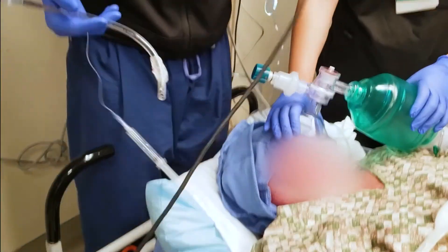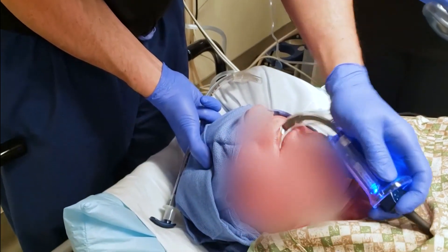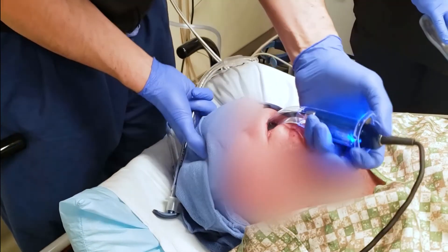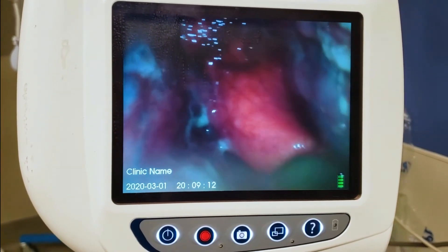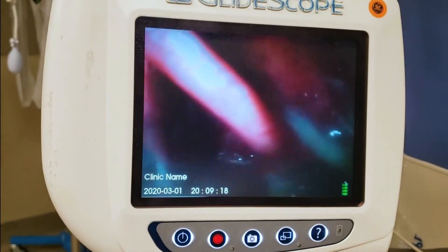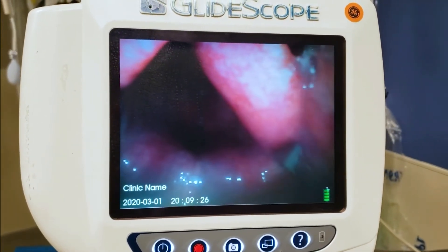With the GlideScope, we're going to go down straight back. As I go straight back, we can see the epiglottis — it's very floppy in him. I go into the vallecula a little more, hit that hyoepiglottic ligament, and pull up and out at a 45-degree angle towards the ceiling.